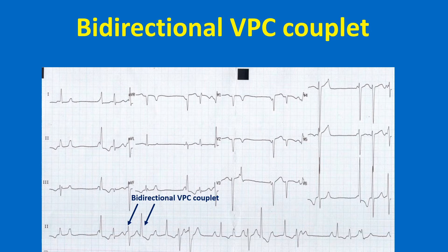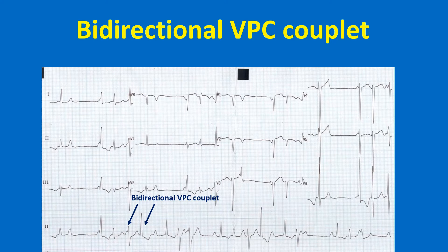Multiple wide, bizarre QRS complexes without preceding P waves are ventricular ectopic beats in this ECG. Since they have different morphologies, they are called polymorphic VPC. Some of the couplets are seen to be bidirectional while others are unidirectional. In addition, there are QS complexes in V1 and V2 with a slightly curved ST segment and T wave inversion, reminiscent of an old myocardial infarction. Bidirectional VPC and bidirectional ventricular tachycardia can be seen in digoxin toxicity, Andersen-Tawil syndrome, catecholaminergic polymorphic ventricular tachycardia, myocarditis, myocardial infarction, and metastatic cardiac tumours.